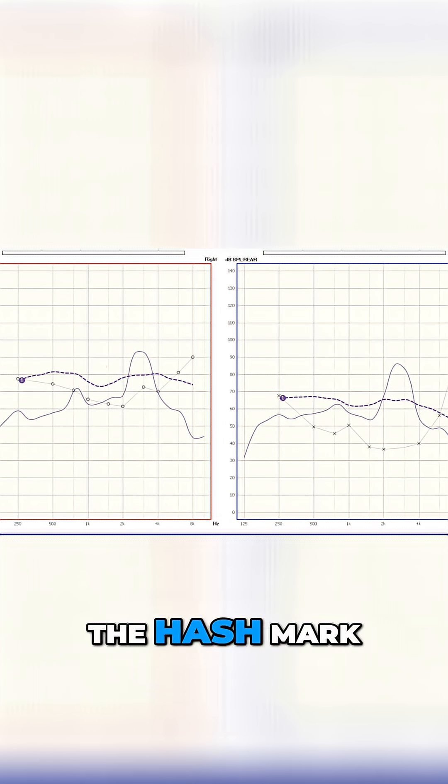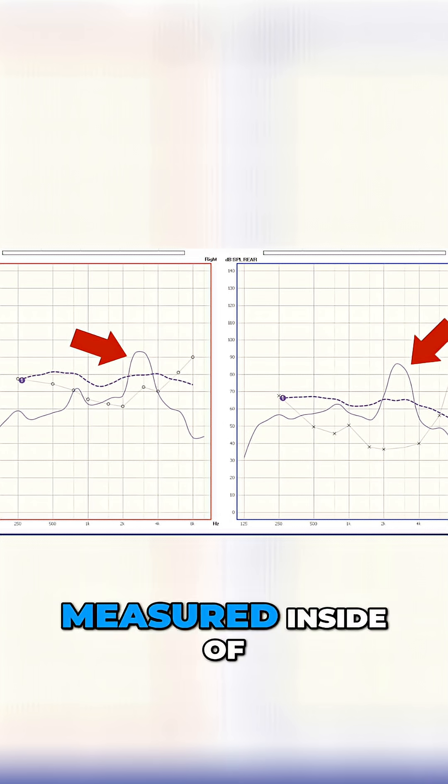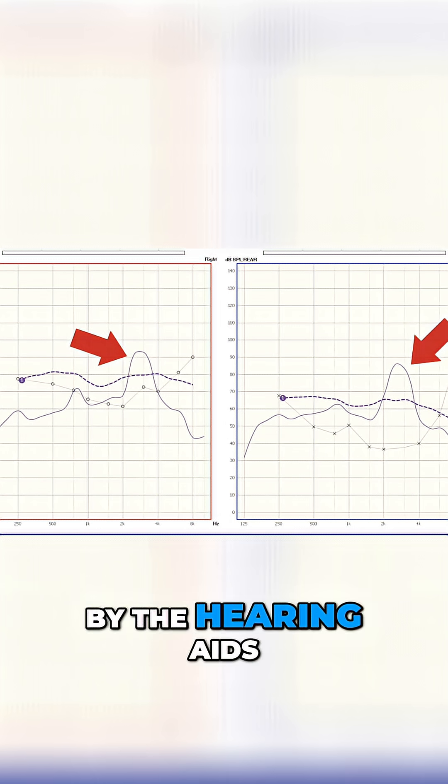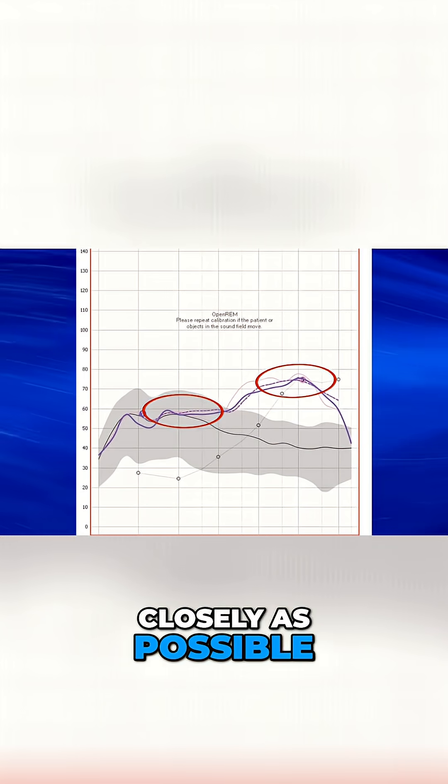Let me explain what we're looking at when we're performing real ear measurement. The hash mark line that you see here is your prescription for your hearing loss. The solid line is the amount of amplification being measured inside of your ear canals after it's been amplified by the hearing aids. Ideally, you want the solid line to overlap with the hash mark line as closely as possible, meaning that you are meeting your prescription.